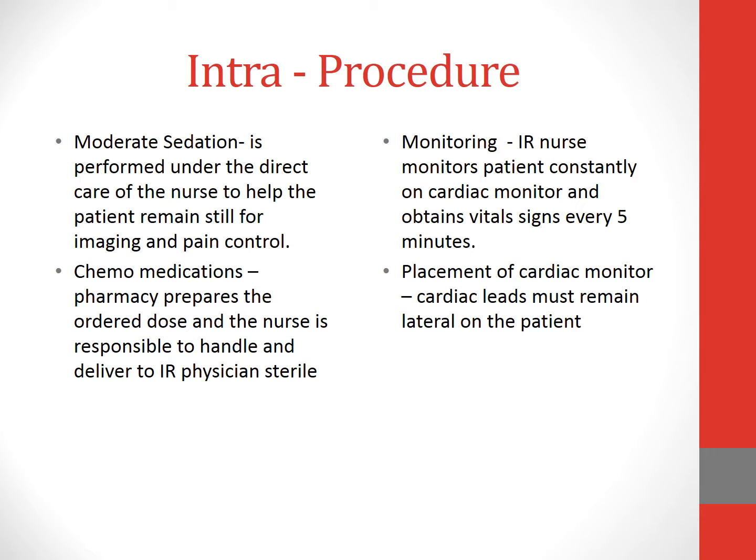Also, in the intraprocedural phase, the nurse needs to be aware of where the cardiac monitor is placed on the patient. We're using imaging, so you need to make sure your cardiac leads are on the lateral part of the patient. And it's part of your responsibility to monitor this patient every 5 minutes after a given sedation.